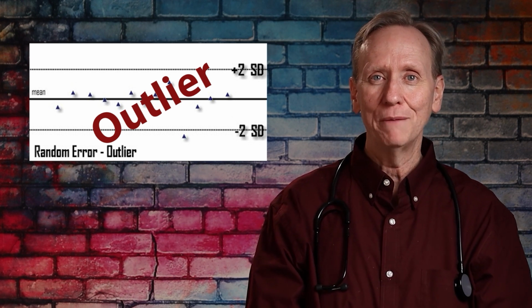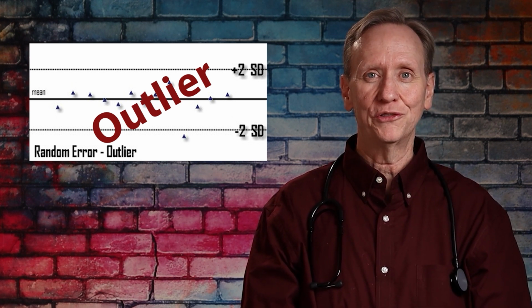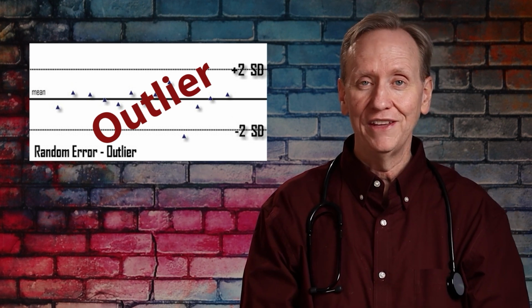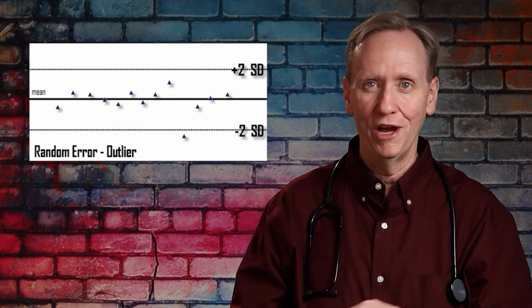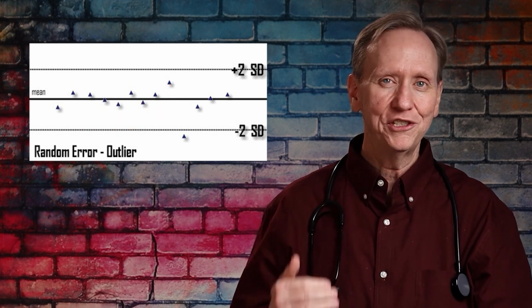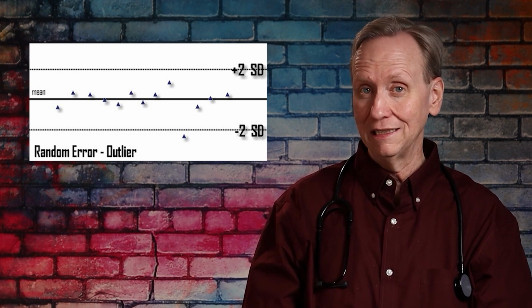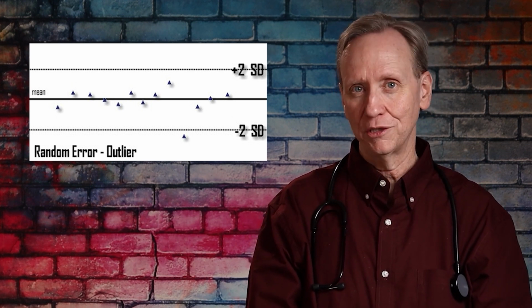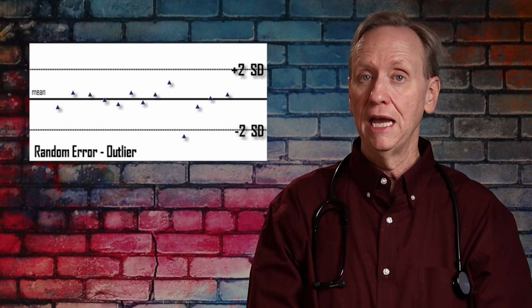Now, most people in labs, that makes them nervous. So if a point is out of control, they'll just do a calibration, a 1-point, a 2-point, or even do some repair if they need to, and then do the control right away again so they can get that back in. They're just settling their nerves. But technically, legally, you're allowed to ignore just 1 point that looks out of control because that's a random outlier, as long as the next point and the points after that come right back in.